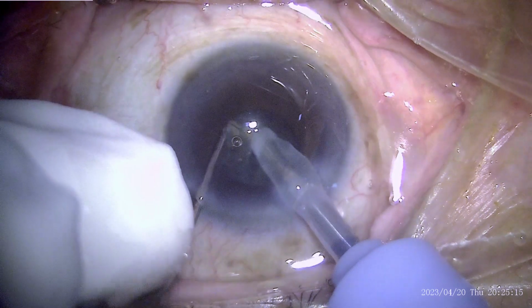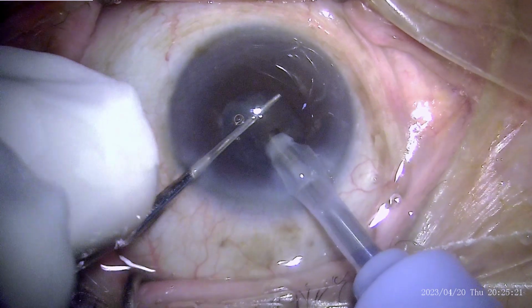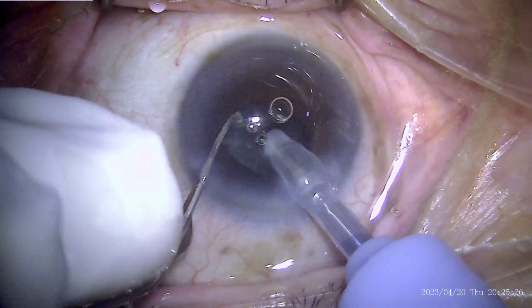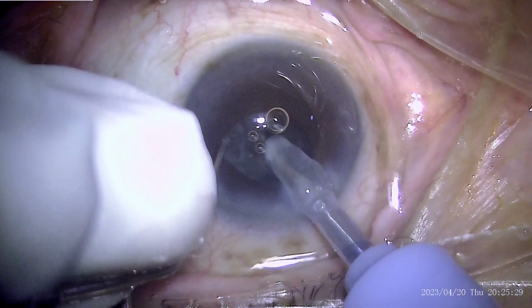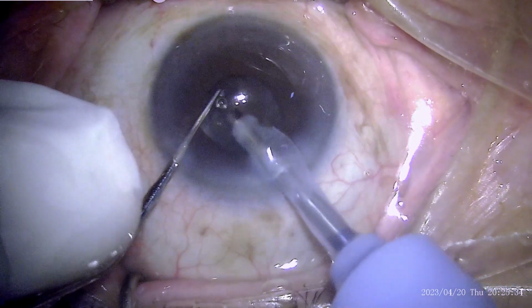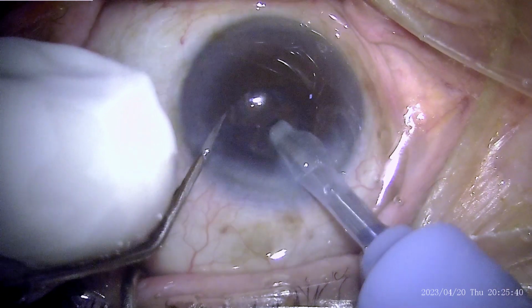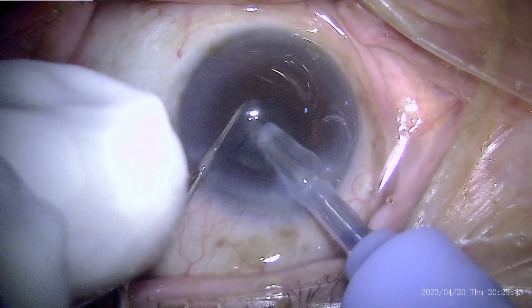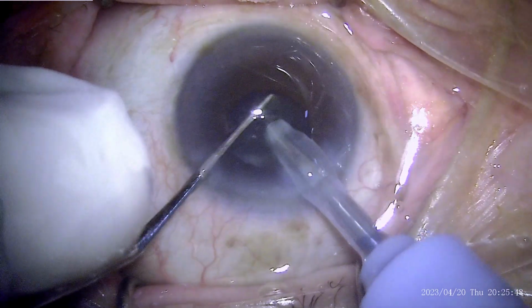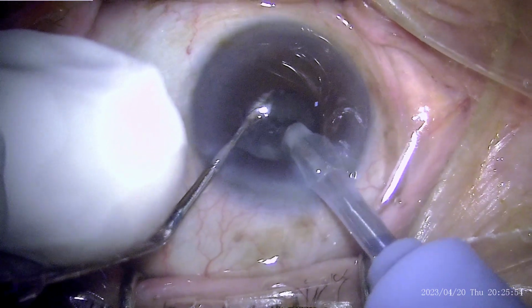Any amount of surge may cause further problems, especially aspiration of the iris, which is very common because iris tissue is very close to the tip, and it may flow with the fluid flow into the aspiration tip. Once the iris has been aspirated, it will invariably get traumatized, and if by mistake phaco power is turned on, then that is going to shred the iris. Although these are not very detrimental for the final outcome, it is desirable not to damage the iris tissue, so that the patient's eye is as good as normal after the surgery.